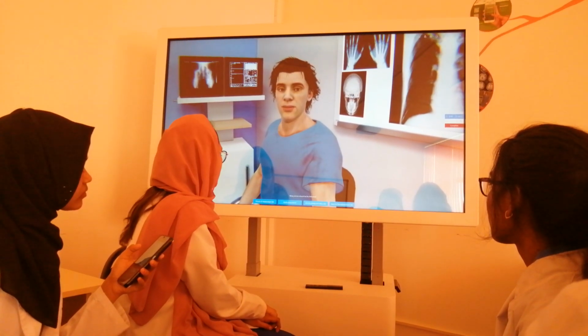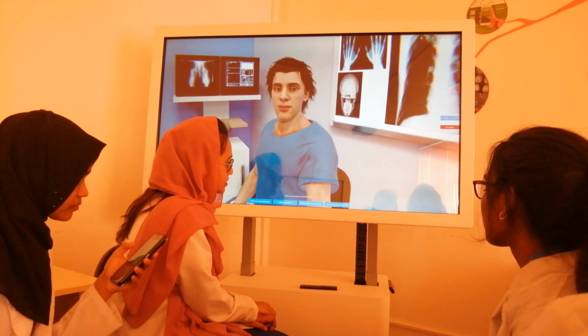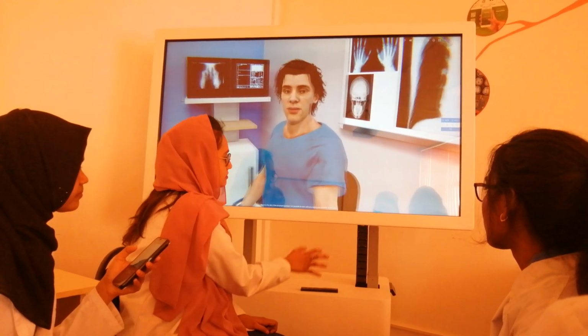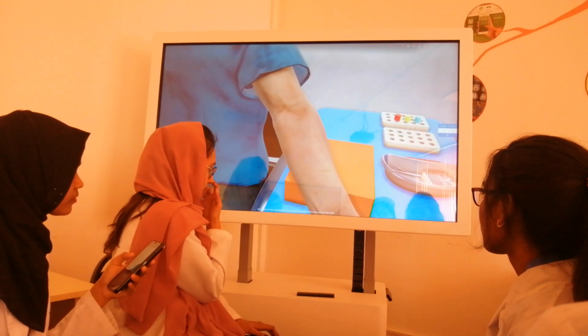What process should be the following? Choice of venipuncture site. Apply a tourniquet. Ask the patient to make a fist. Examine the venipuncture site. Examine the site of the proposed puncture. Is it possible to inject without a tourniquet?